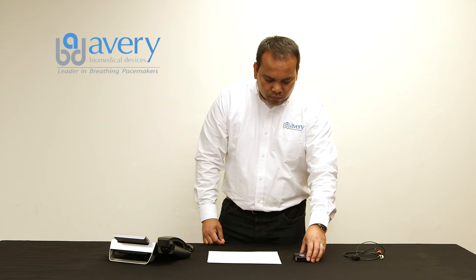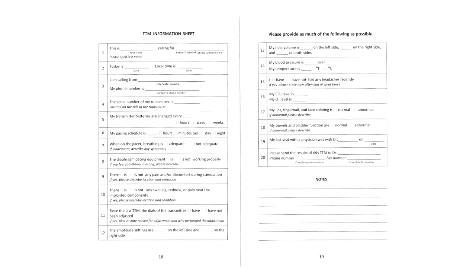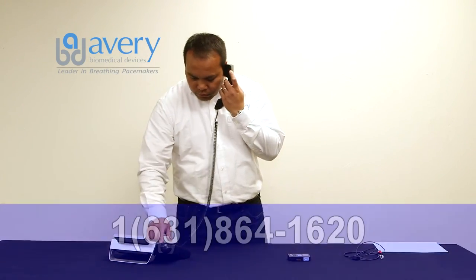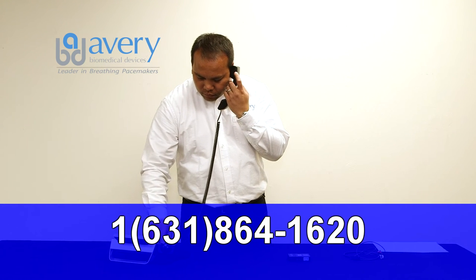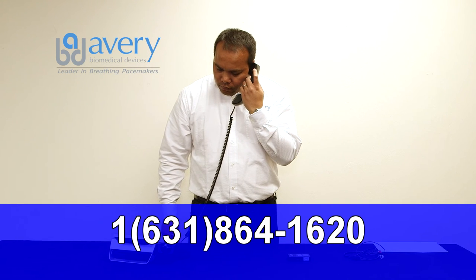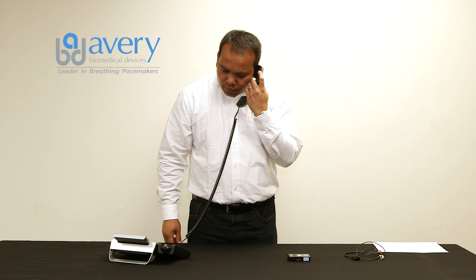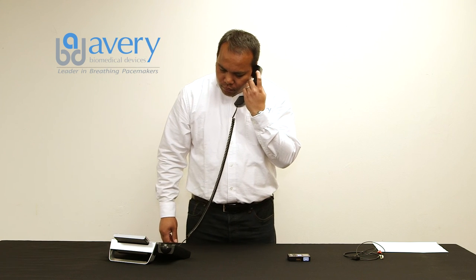Place the TTM on a flat surface with the speaker hole facing up. Have the TTM information sheet ready. Dial the telephone number for the TTM receiving station: 1-6-3-1-8-6-4-1-6-2-0. Use a corded landline telephone only. Cordless, cellular, and VOIP telephones do not work for TTM transmission. After several rings, you will be prompted with information on how to continue the TTM transmission.